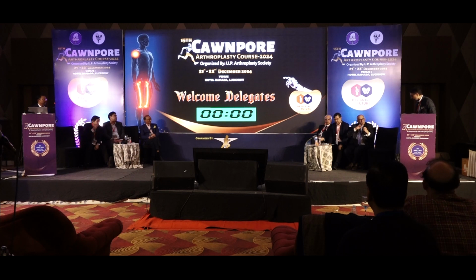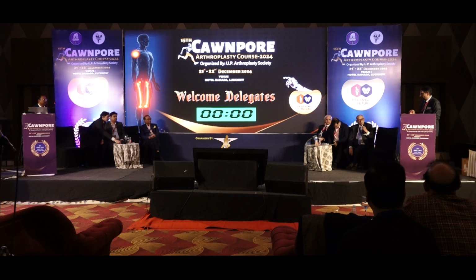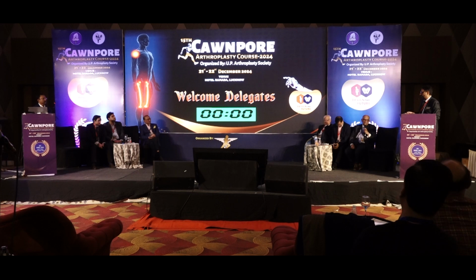You said you will be cutting the tibia along the native slope. That is very, very important for the PCL to work properly in roll back because we don't know what is the slope of that particular patient. And that is why for the last almost 10 years or so, I moved from EM or navigation to IM jig, because the first criterion is I should have an IM jig to cut a tibia for a CR knee.